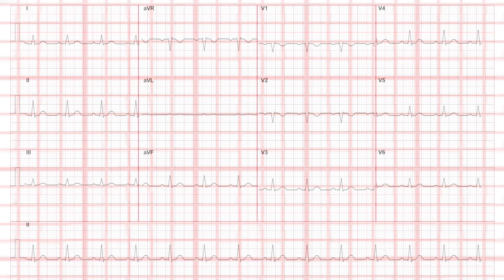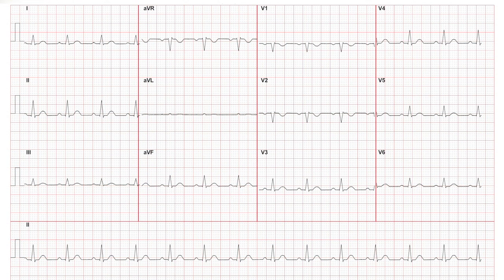This is the representation of a full EKG. There are typically 12 different ways, or leads, to look at the heart, which are represented here. In some instances, additional leads can be added to the patient's back to do a 15-lead ECG, or a right heart ECG if you add the leads on the right part of the torso.